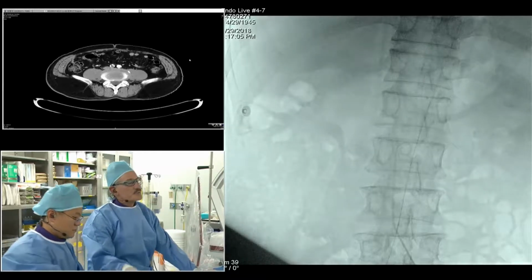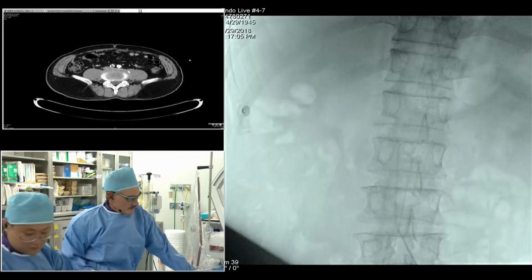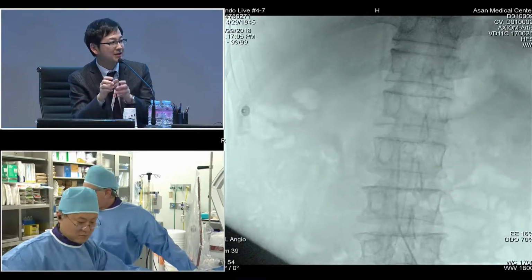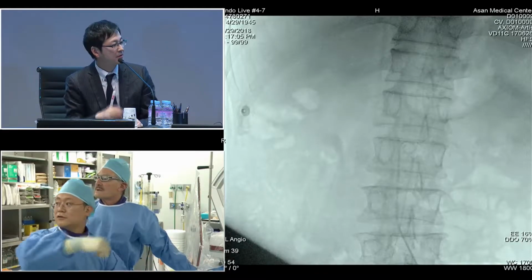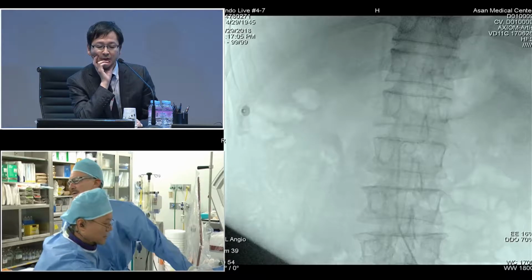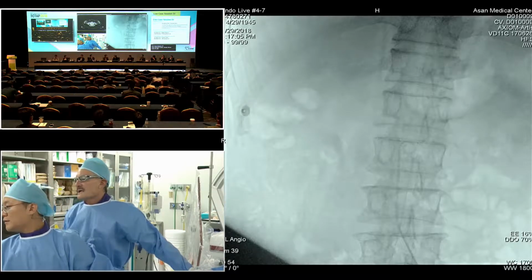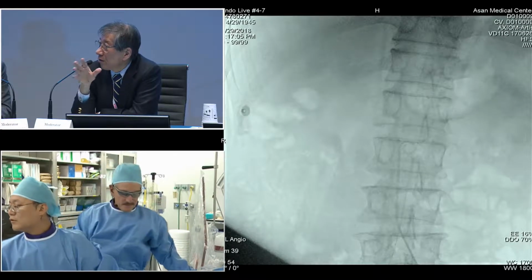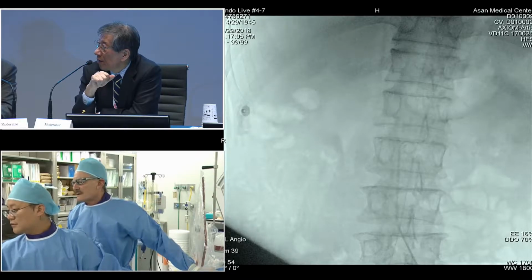Okay. So we find a moderate stenosis on the left side. So how do you manage the ostium? Just a simple stent for the right side or a kissing stent technique, or we have to discuss this point after successful wire crossing. And the vessel size is a little bit small for the common iliac artery in this patient. Not 10 or 12, but around 8.